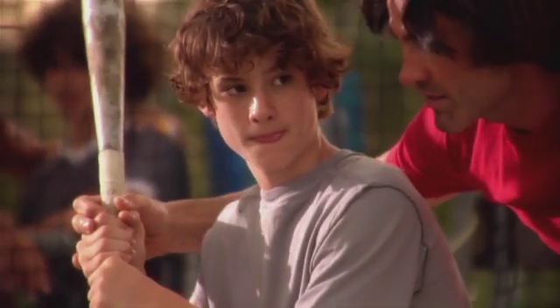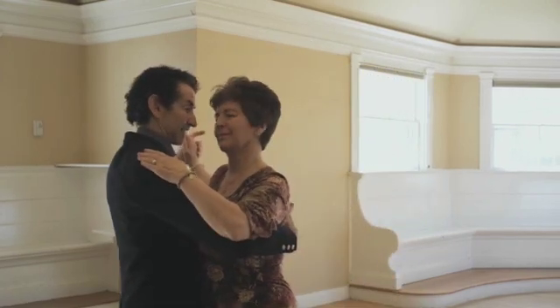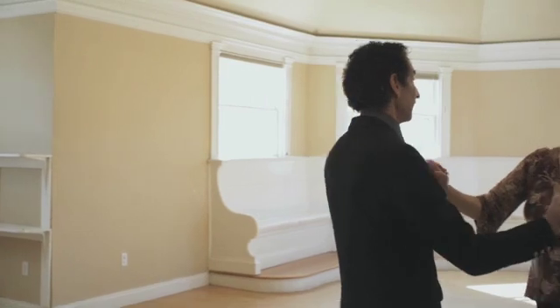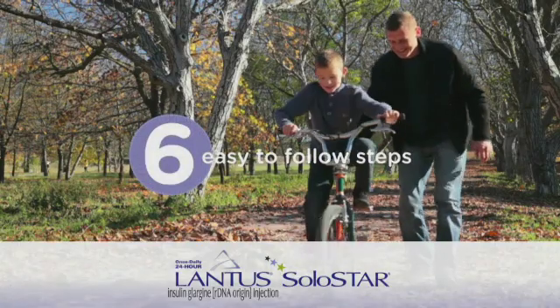Remember what it was like learning how to play your favorite sport, or learning steps to a new dance? Wasn't it great to have someone there to teach you? Now that you want to learn how to use the Solostar pen pre-filled with Lantus, we're here to teach you how to do it in 6 easy to follow steps.